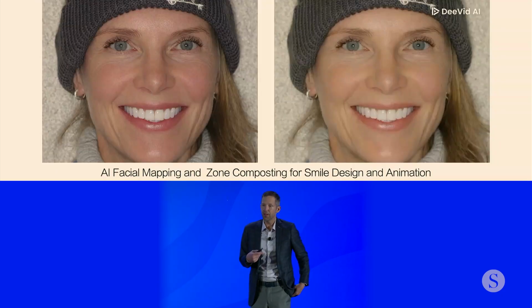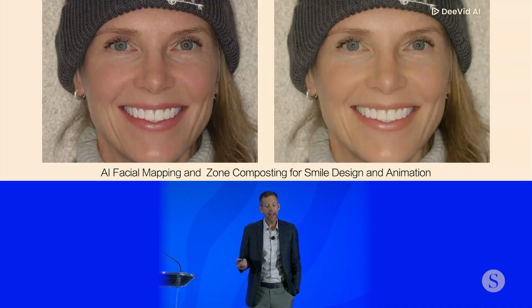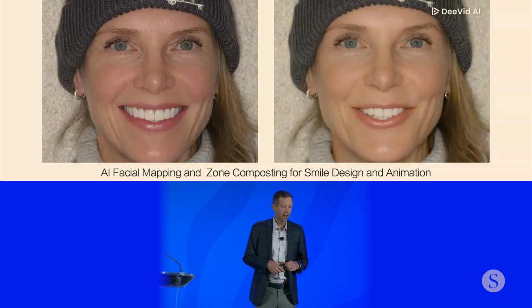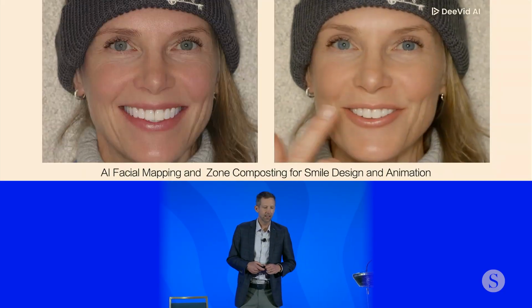But all these Smile Design softwares are doing is using AI facial mapping and something called zone compositing. And you can actually take this picture and animate it. So on the right-hand side, this is just AI animating that picture of my new Smile Design. Now, what I do not like about these solutions is it's extremely difficult to know, can you execute it? There's no biology, there's no bone, there's no tissue, so it's a little bit unrealistic for me to propose this to a patient without knowing if I can do it.